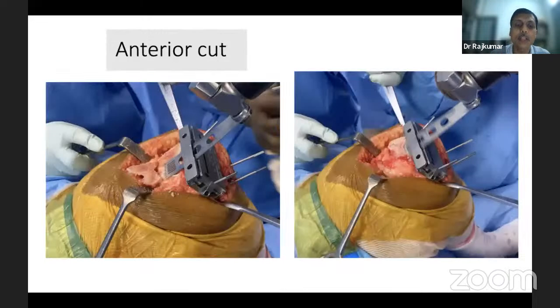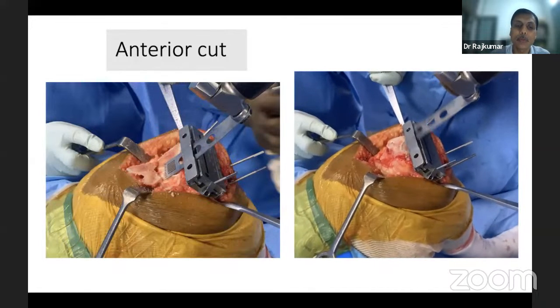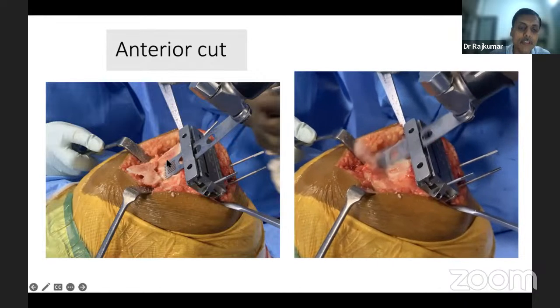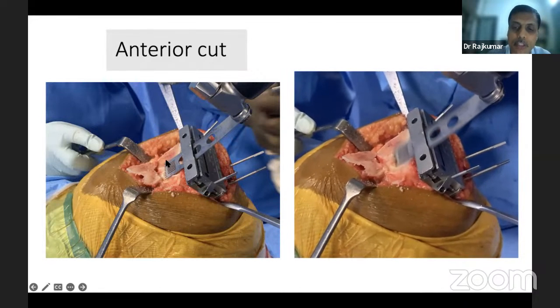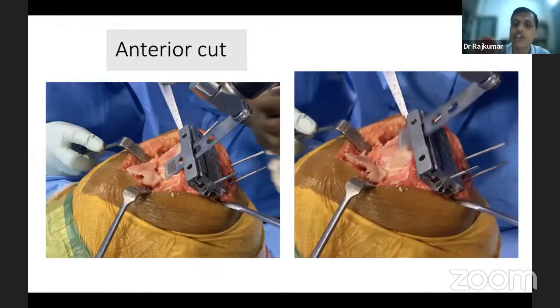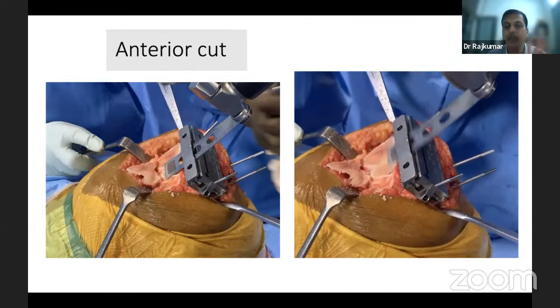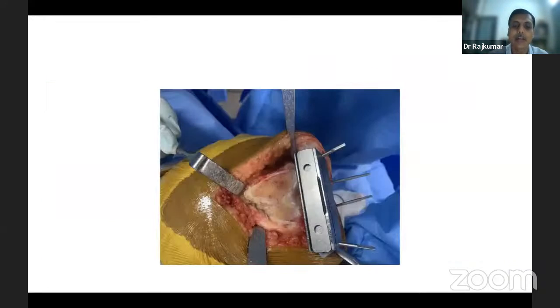The moment you do that, you can take the anterior cut. You make sure that you don't have soft tissues covering, because you may not know. The moment notching is expected or seen, stop. For that, you need all these retractors to make sure the visibility is proper. After the cut, you can see this piano sign, great piano sign.